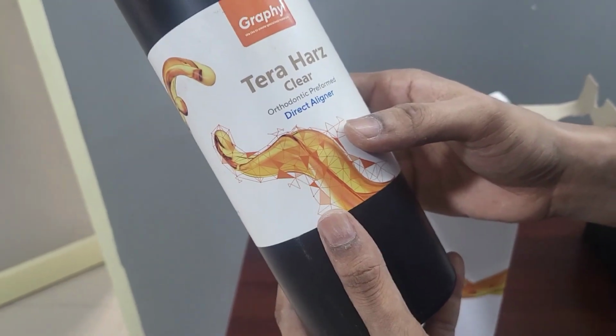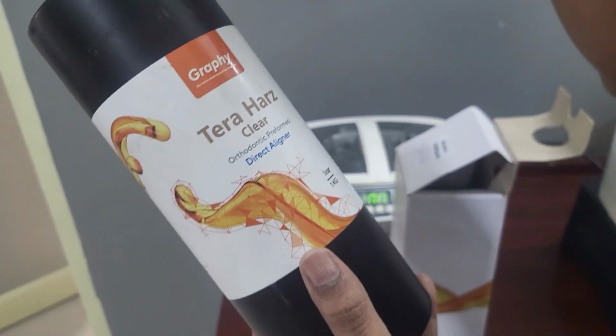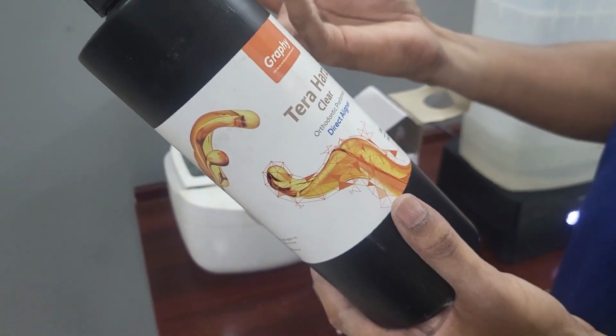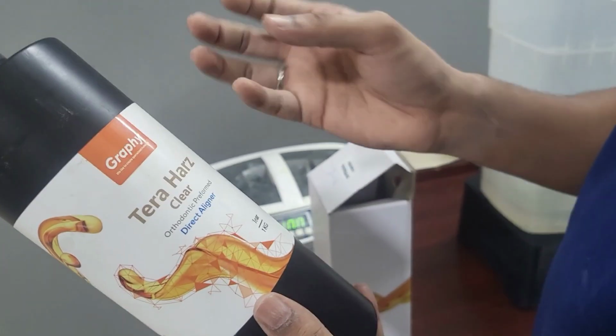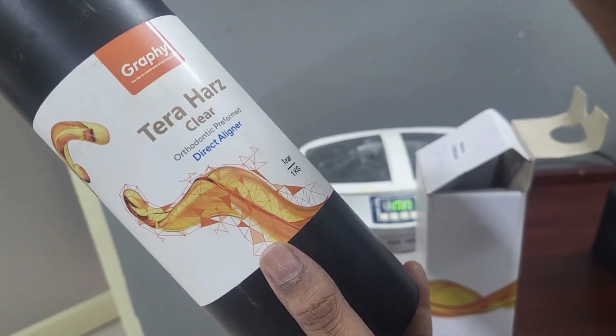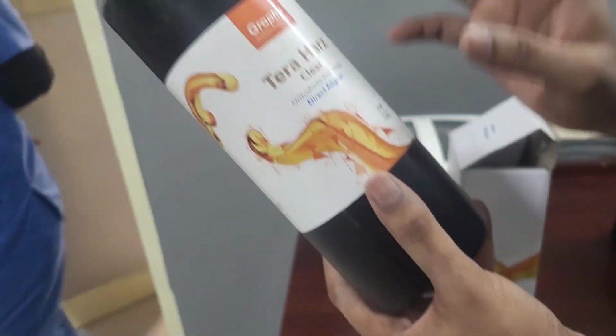The doctor says that all the printed models are a waste after delivery, but you have to keep them for review in case any mistake happens in between the treatment. If we use this biocompatible resin, we can bypass printing the models, but it's not cost effective, and it's procedure sensitive also.